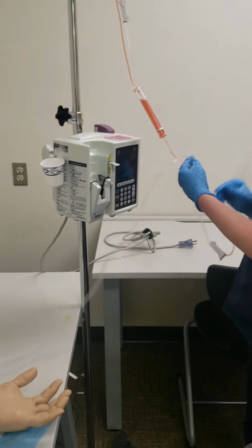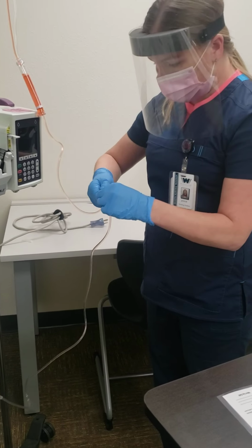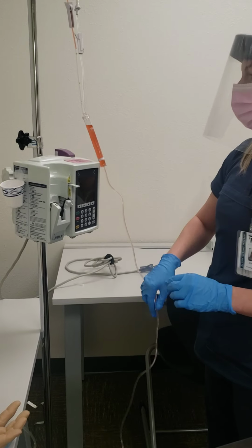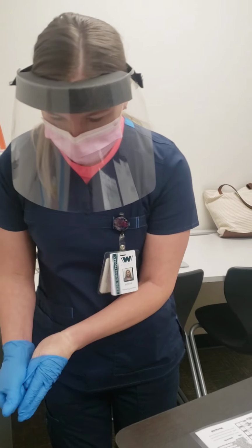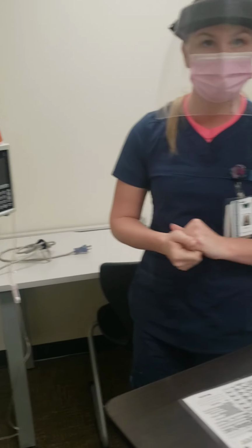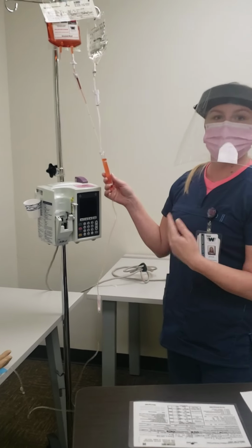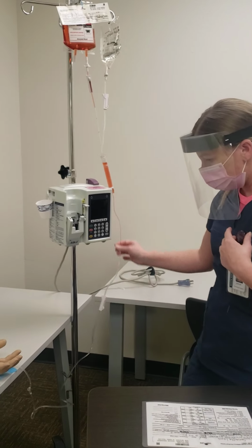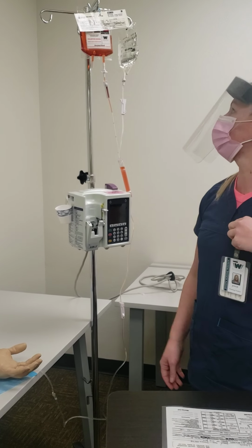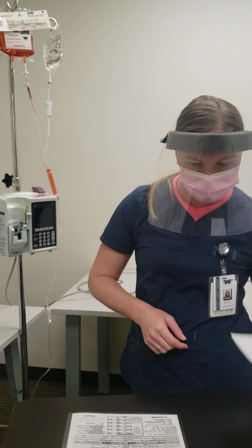And open this clamp. Now that I have started it, I'm going to go ahead and get a new set of vitals. And I will sit with my client for 15 minutes to just note any adverse reactions to the blood. I want to make sure to set my drip chamber at 15 to 20 drips per minute. And like I said, I'll just sit here and monitor the client, make sure that the blood goes in within 1 to 4 hours of administration.